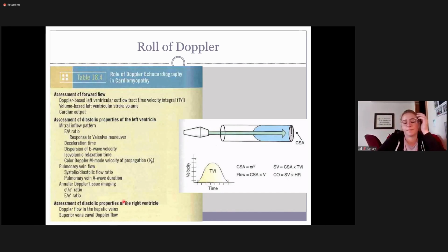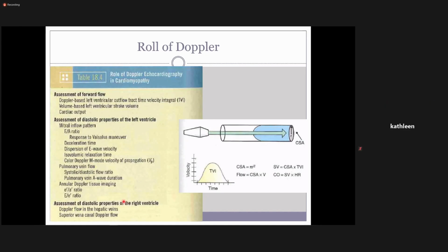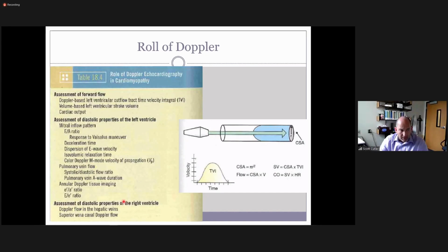Okay. Yes, good. That's a good question to make sure that we're clear, because sometimes we just assume that everything is diastolic function because it's tissue Doppler, which is the place that we use it most often. But if we're looking at the S wave, that is an indication of systolic function also. And I believe on the S wave, you could actually trace that to give you an idea of the peripheral vascular resistance also in the lungs. So those are just measurements that could be applied. Most often are not applied, but they could be applied.